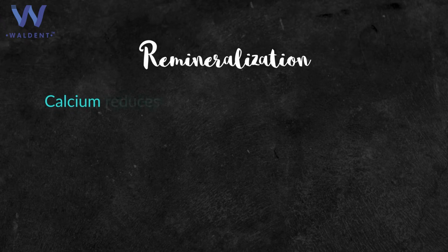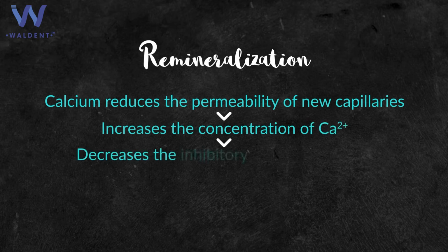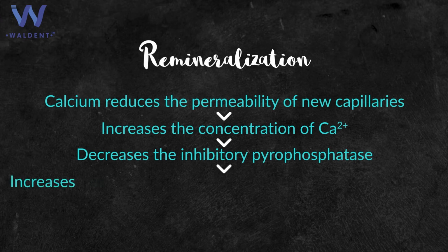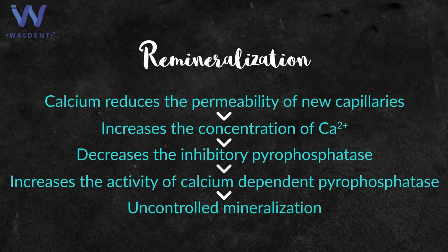Remineralization. Calcium reduces the permeability of new capillaries, so it increases the concentration of calcium ions. That decreases the inhibitory pyrophosphatase, which in result increases the activity of calcium-dependent pyrophosphatase, and that causes the uncontrolled mineralization.